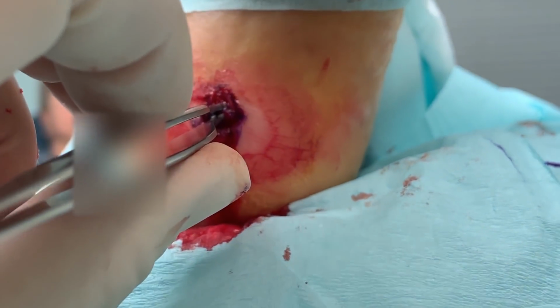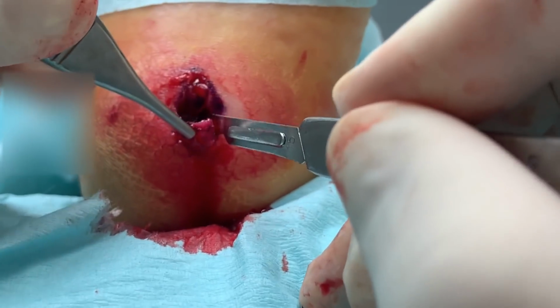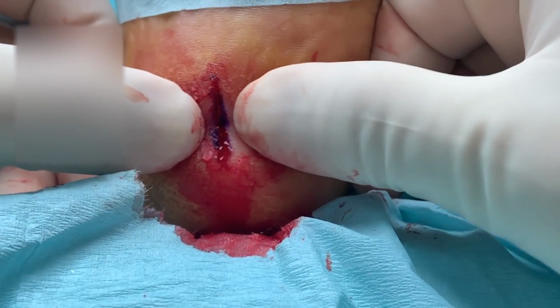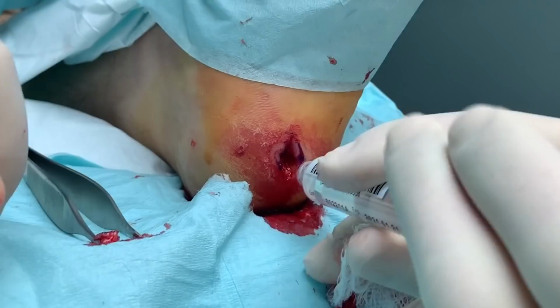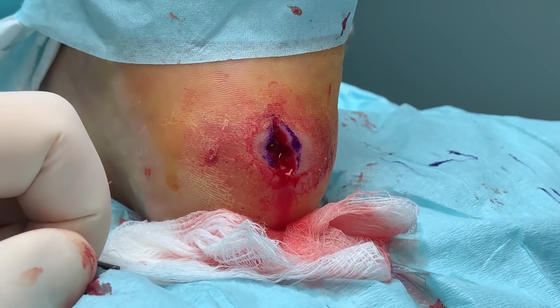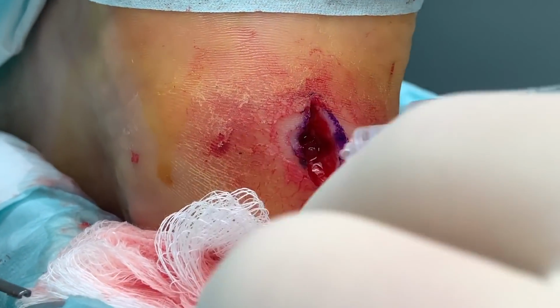All right. There we go. Look. We'll have James flush it out really well too. Want to dab real quick, James? There, see? And it's gonna close nice and easy like that, or nice and tight. Okay, let's flush. Flushing, the actual saline itself doesn't really matter. It's the flushing mechanism that gets all the bacteria out.